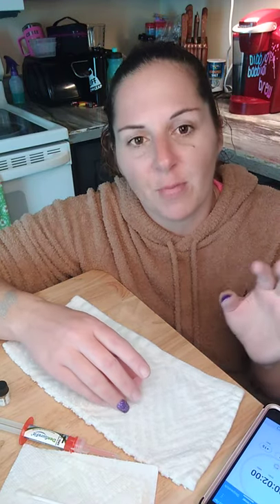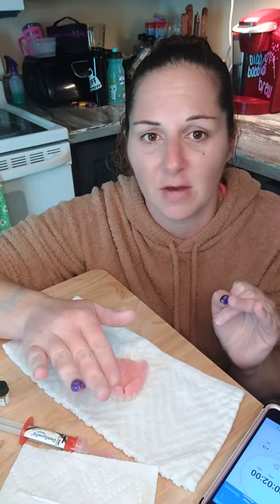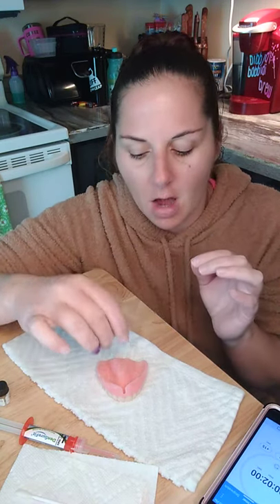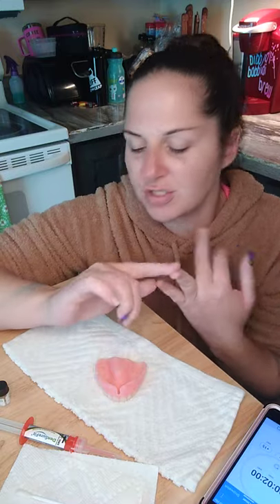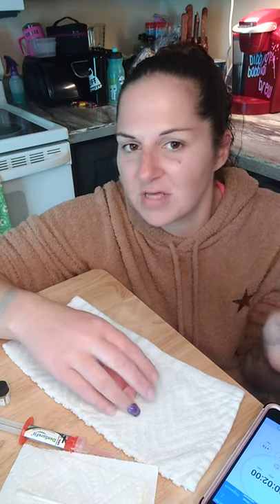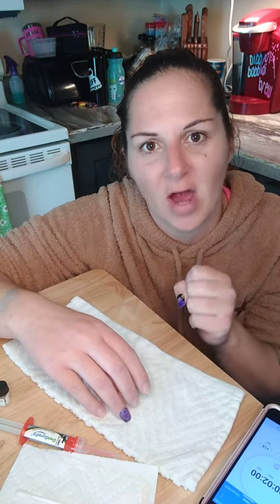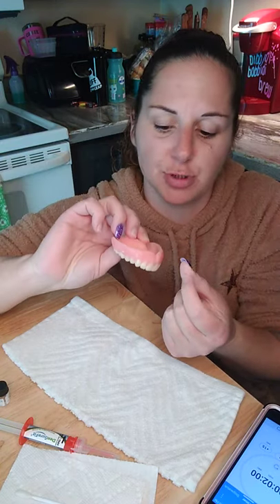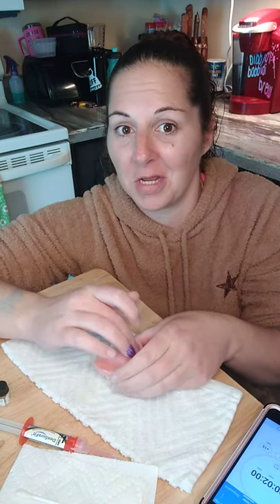So just to back up, the first step is to clean your denture. Make sure there's no adhesive and no extra soft reline in there. You can use it with a dentist's soft reline, but it is best to have it completely cleaned out. Wash it well. You don't want oils or residue up in your denture, because the silicone has to stick, and it's not going to stick if there's a whole bunch of stuff in there. So make sure it's thoroughly cleaned and 100% dried, guys. Don't leave a little bit up in the corners. Mine goes deep, so you have to get a Q-tip to dry it out. I'm making sure mine are dry. I have to, because I get paranoid.